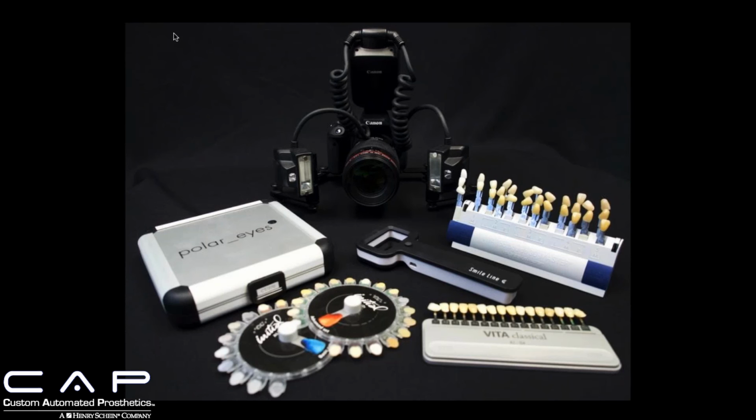And what that does is it exposes all the little color differences and translucencies, and it helps you figure out what you're looking at and gives you more detail.